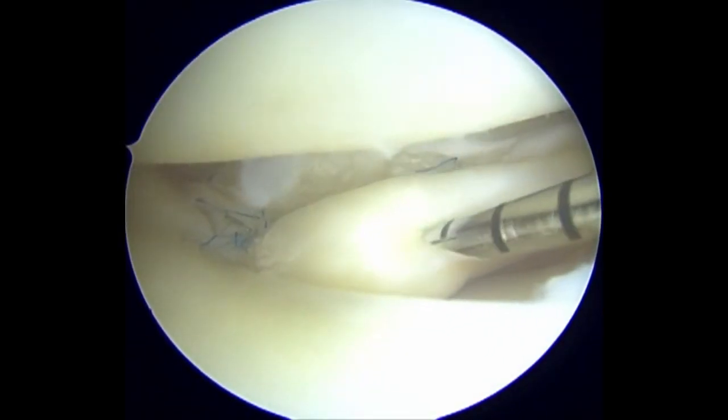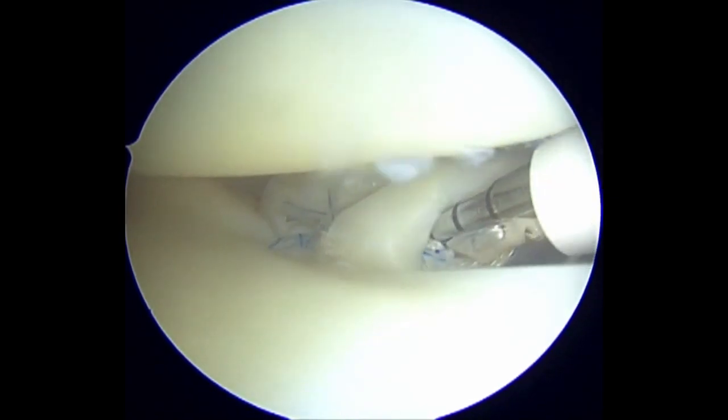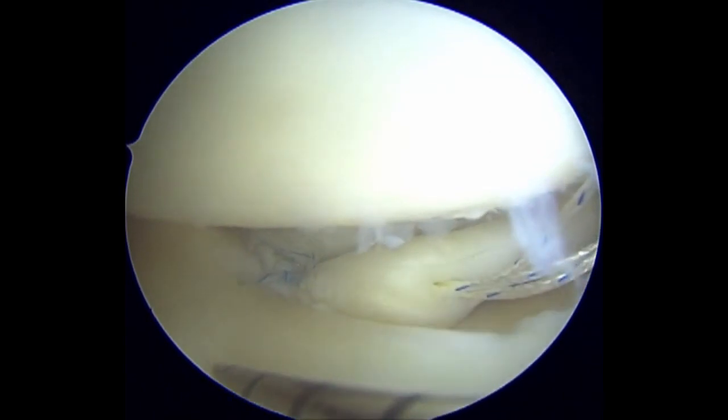A third side-to-side stitch is placed at the central aspect of the radial lateral meniscus tear. This helps to re-approximate and close the radial tear gap.